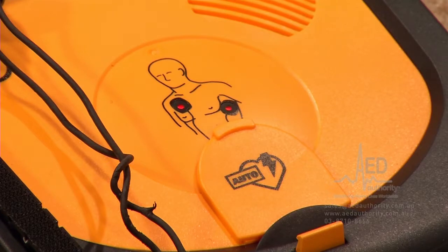As soon as the pads are in place, these lights turn from red to green, and the AED will immediately start to evaluate the heart rhythm.